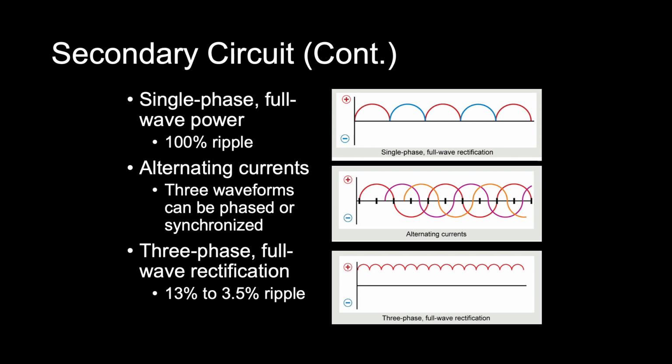It's a terrible waste not to rectify the waveform. When we rectify each one as if they were a single phase waveform, the X-ray tube sees the waveform like the one in the bottom figure, which is the 3-phase full wave rectification. This is referred to as 3-phase power. Although this is obviously less ripple than the single phase waveform, it still has ripple.